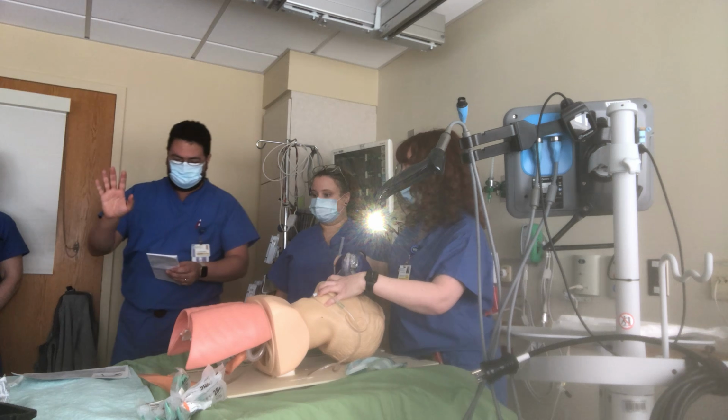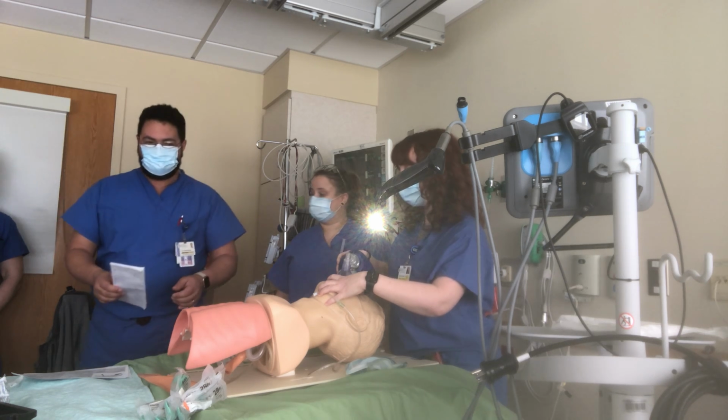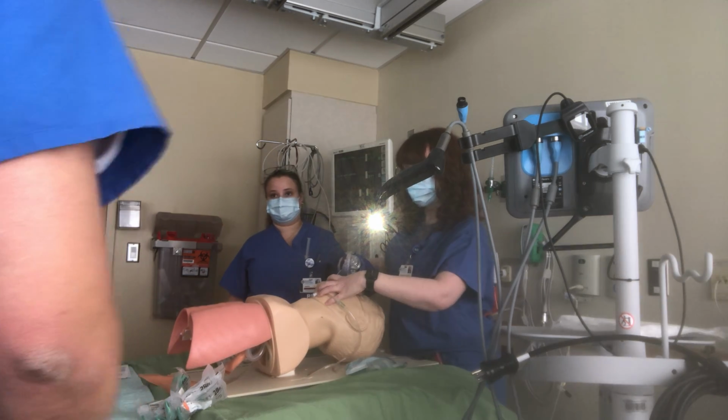Okay, now there's a different scenario here. He's actually difficult to ventilate. He looks like Santa Claus. So we can't ventilate him, and let me come from the other side, and I'll show you something here.